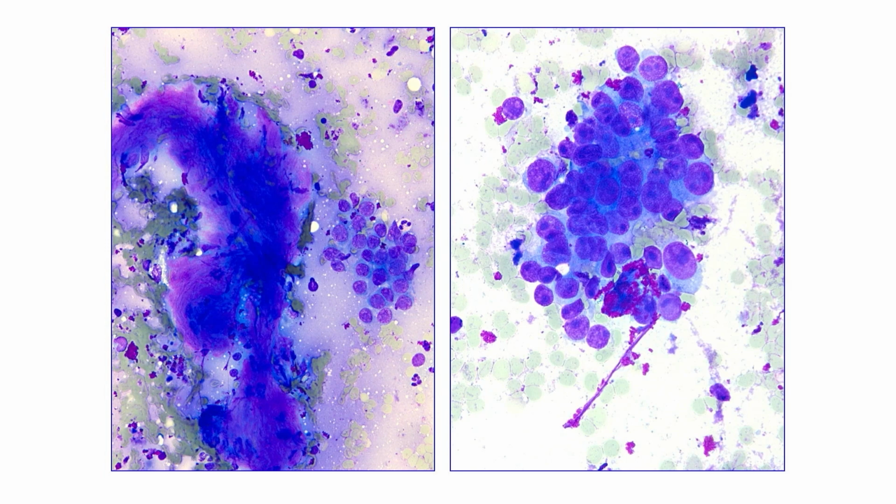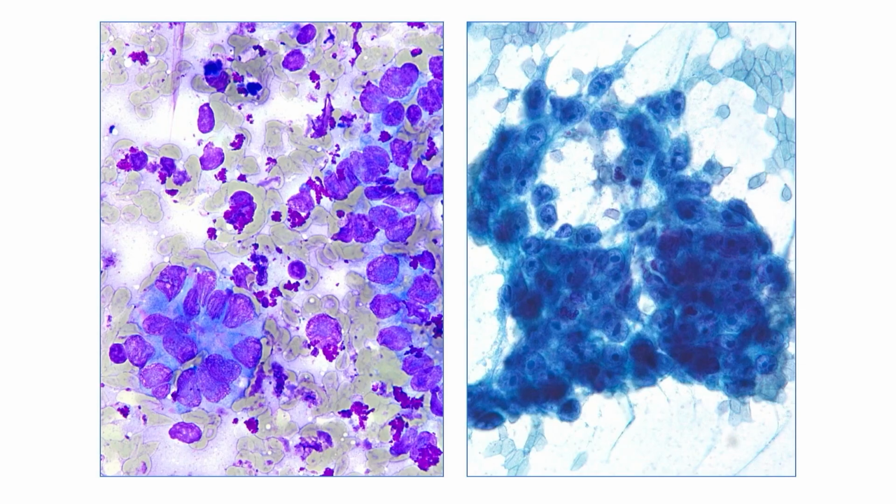Some substance was present, either amyloid, colloid, collagen, or something else. Again, the same cells, some lymphocytes as well. Higher magnification shows you the most impressive macronucleoli in these cells in a background of open chromatin. Again, suggestion of whether there is gland formation here. Same thing going on here, open chromatin, macronucleoli.